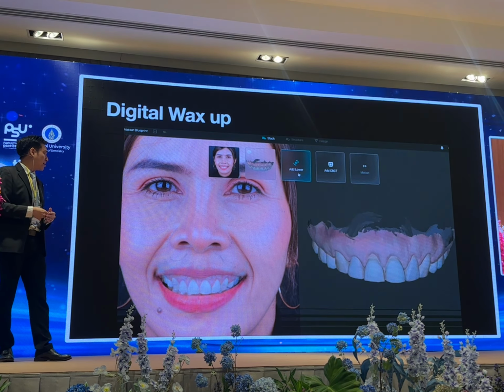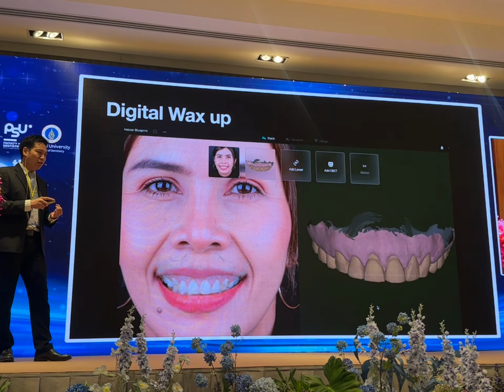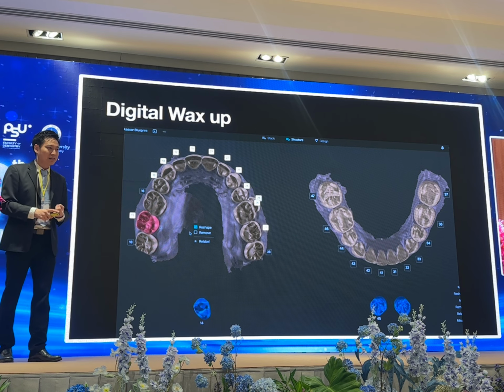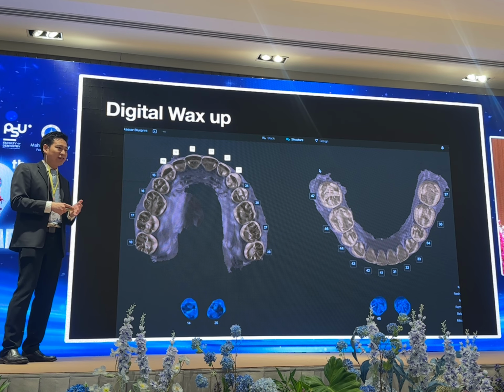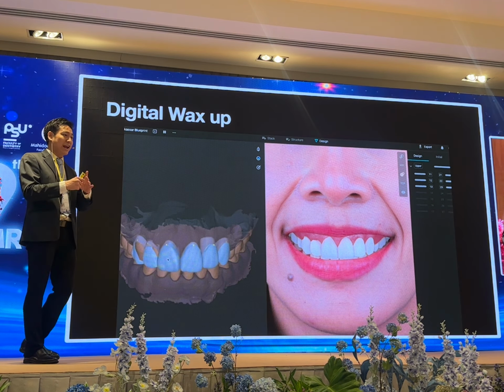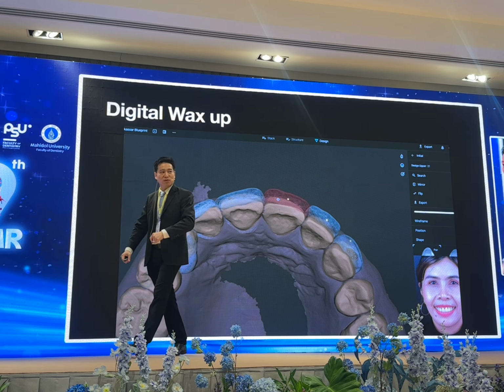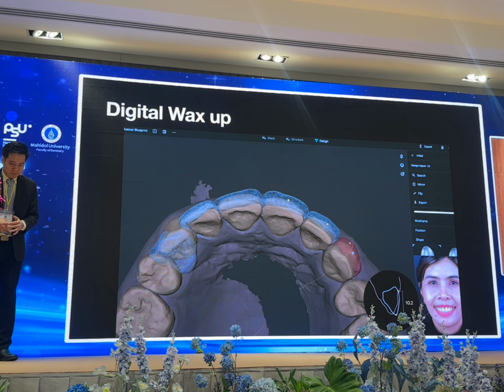You can mark where your high upper papilla is, and alter it to where it's supposed to be, such as incisor edge position and smile height. In this case, at the beginning, I saw that the patient asked for just 6 teeth, but it would be a lot better if he did 8 teeth, because when he smiles, we can clearly see the premolar is still visible. But due to financial limitation, the patient just went for 6.